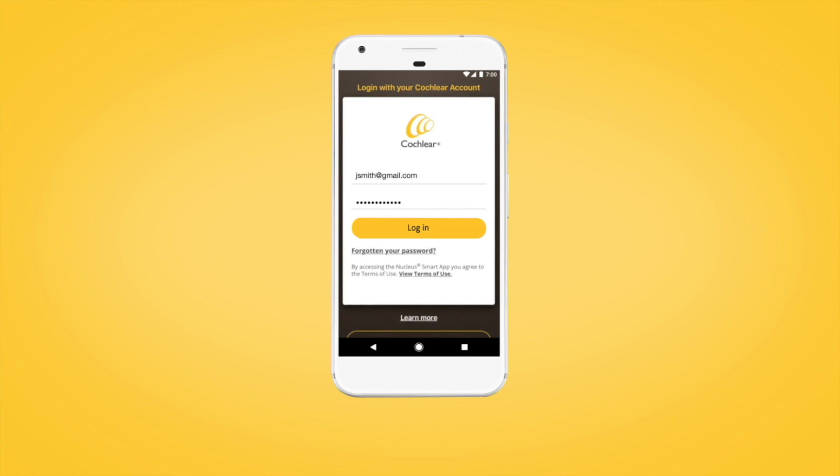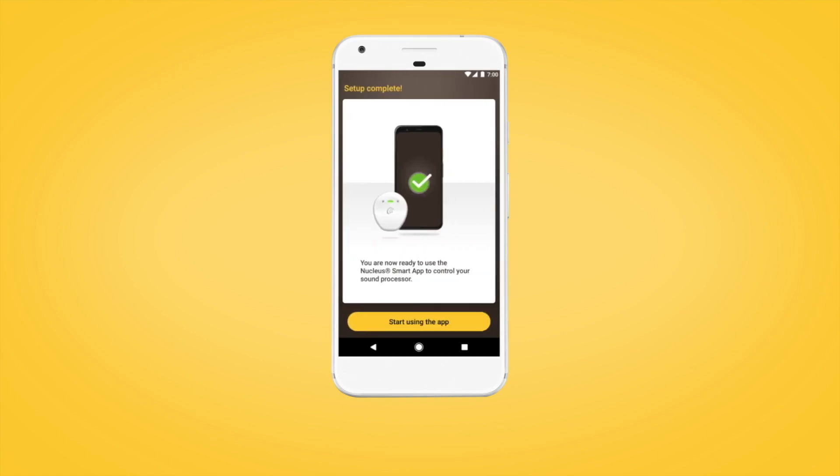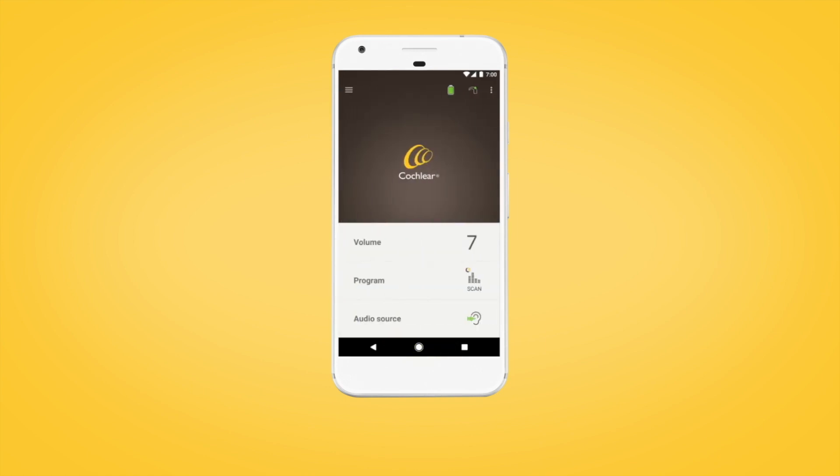When setup is complete, select Continue to begin using the Nucleus Smart App.